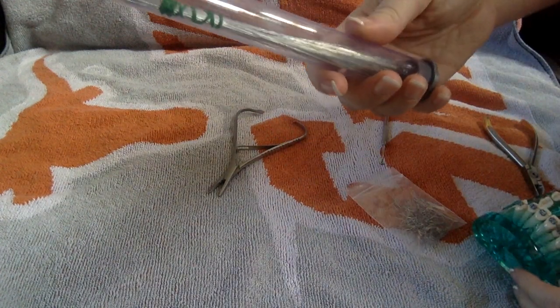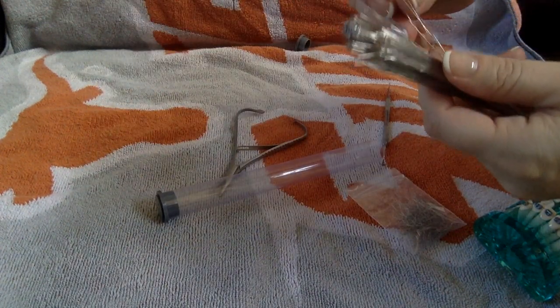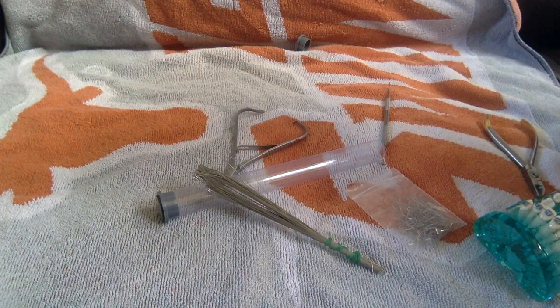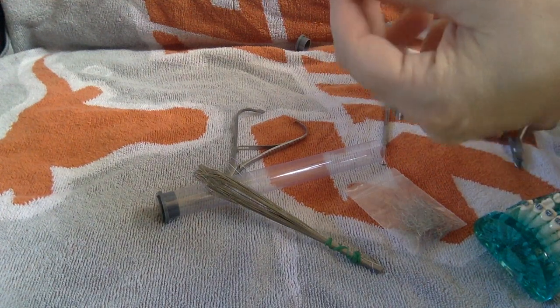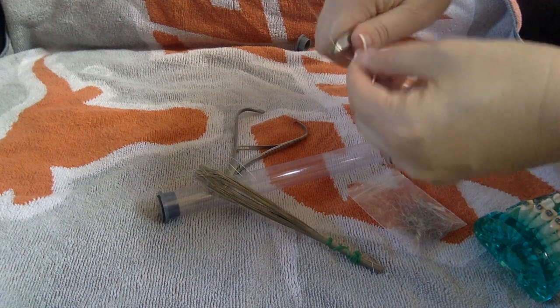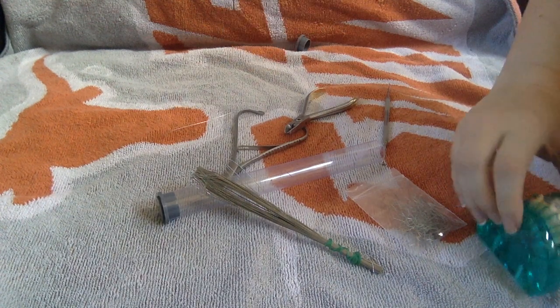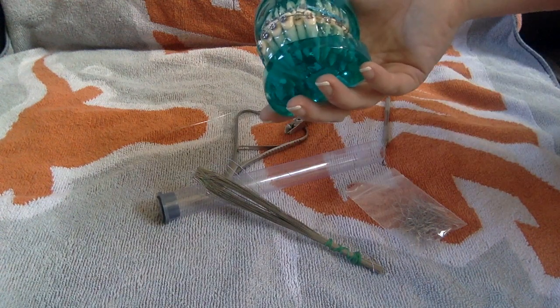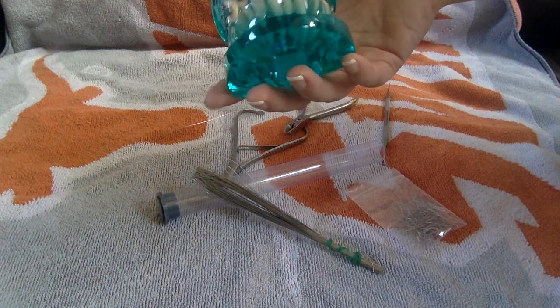The long ones work fundamentally the same way. Sometimes it's great if you can package these separately so you're not grabbing them with your gloves. Grab it the same way as you did the other one. For me these are kind of cumbersome for a single tooth — I use these for other things like anchorage. But if I only have this, I'll go ahead and clip it maybe halfway down so it's not so long and not flying in the patient's eyeball. You preform it and grab it the same way. That's how you stainless steel tie a tooth — it's really simple and very easy. Always check it with your glove to make sure it's not catching, and give the patient instructions to tuck it back under with a pencil eraser, or a proxy brush if they prefer — that's a little more hygienic.